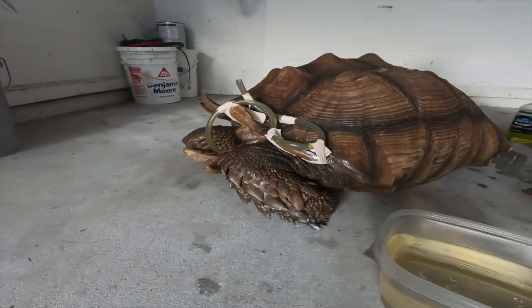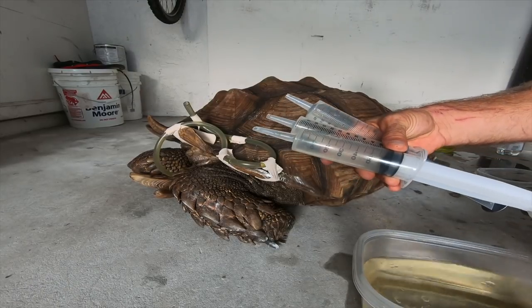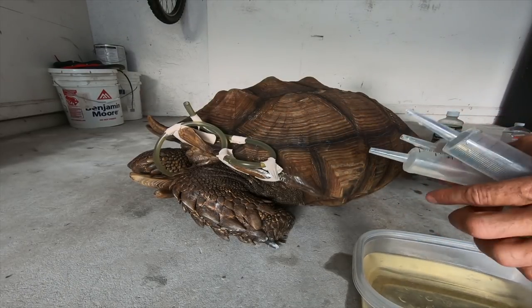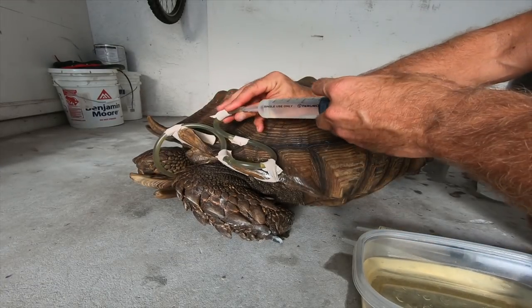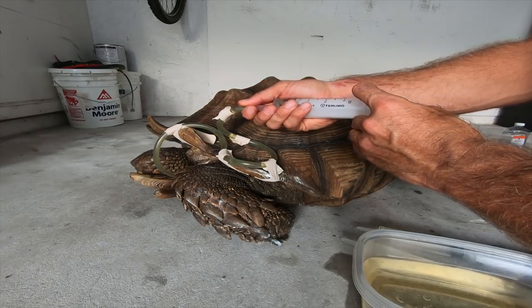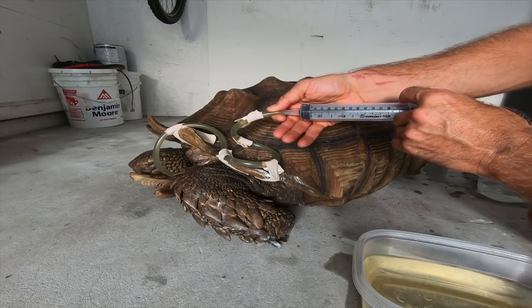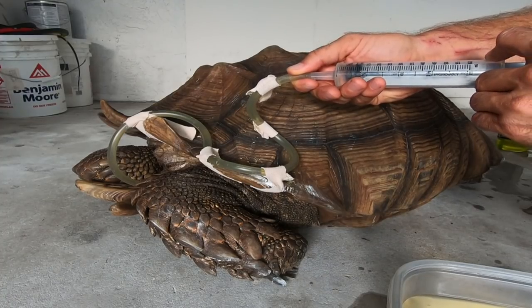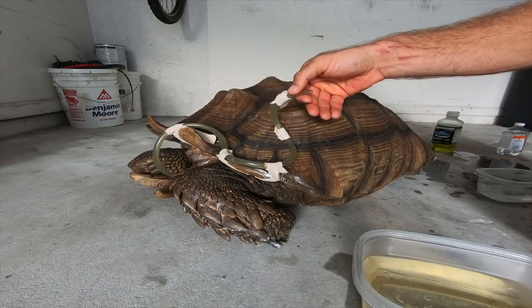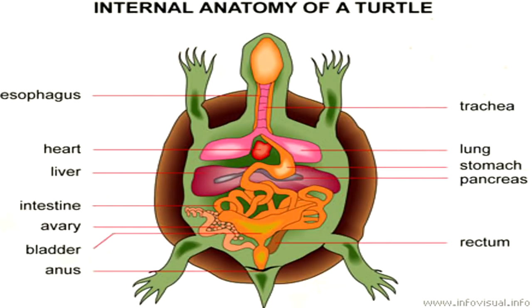All right, so what I figured out is we're going to need 3 more syringes with Metamucil into this guy to bring us up to 500 milliliters. We're also going to rinse it out with this water here, because we want to get this guy hydrated, and the Metamucil is also going to do more than just that. It's actually going to help him get some fiber into his belly. And that fiber is going to help bind up and get his gut moving again so we can correct the constipation issue.